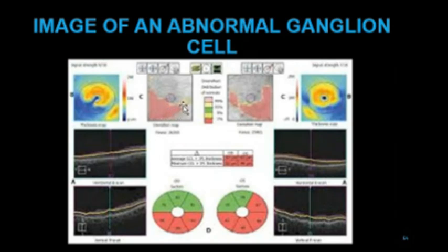But some parts are yellow. Have you seen some parts are yellow here? Also, if you look at this place, some parts in this green part, some parts are yellow. Those are the blue parts. So it's showing that there's a loss in the ganglion cell here. I know glaucoma affects the ganglion cell. Also, if you check this place too, you see that there's a loss here, which is also in line with this loss we are seeing here.